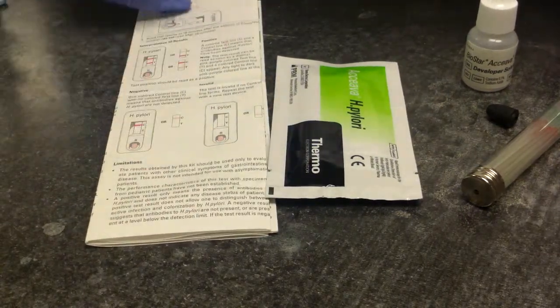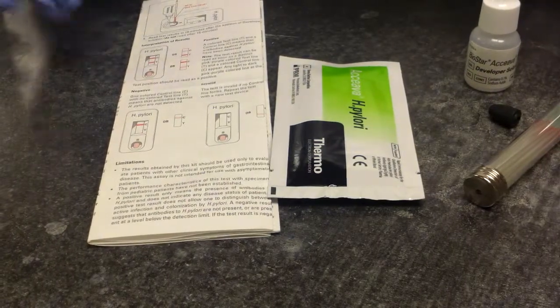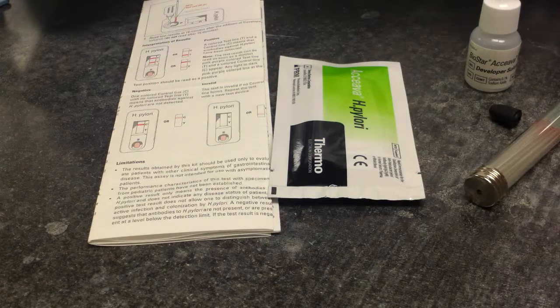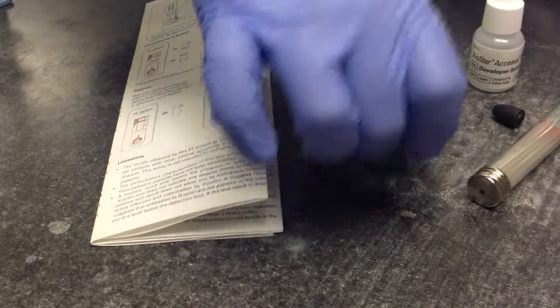Once again, we have our little idiot sheet or pictures, which makes it a lot easier to do these sometimes, but there's a lot more information in the package insert, so if you ever have questions, all you have to do is refer to it.